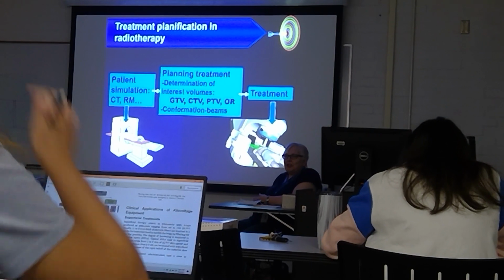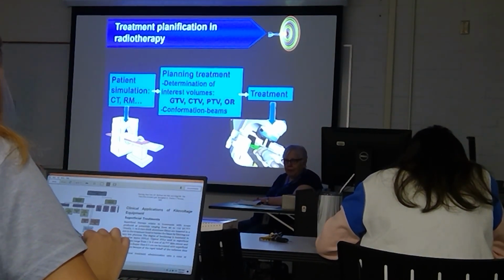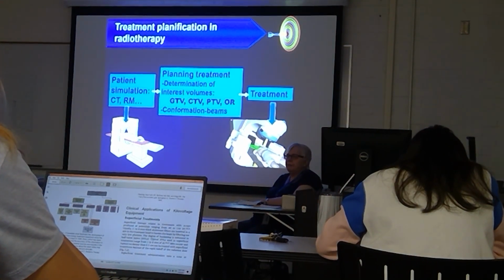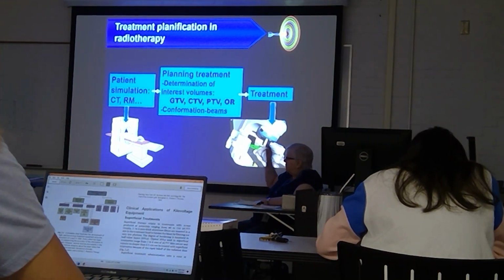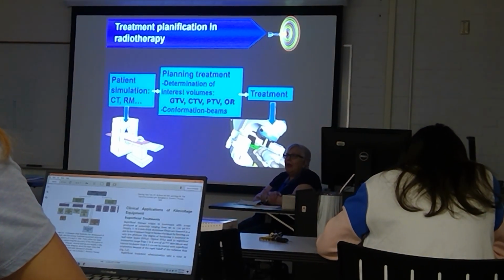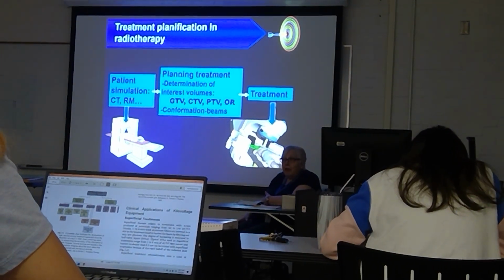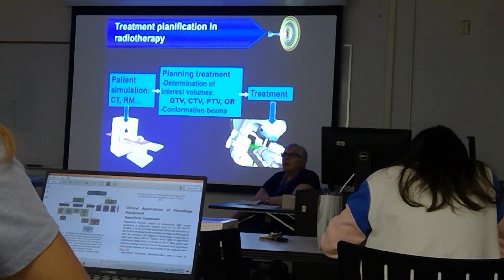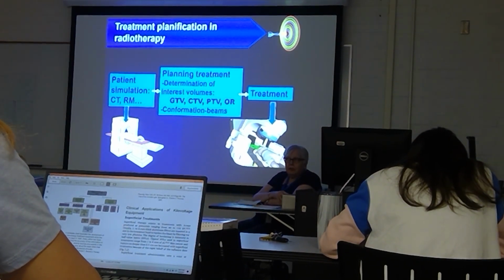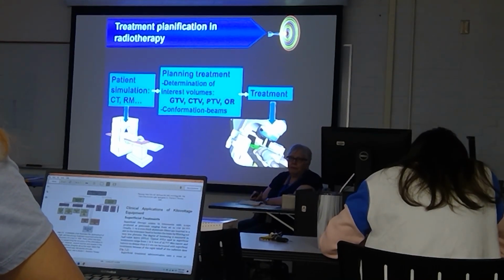99.5% of our patients, we do head first in CT. Give me something that wouldn't be treated head first. The bottom of the foot. The foot, actually, I was just about to say, till mid-thigh. If you were treating any of the leg, you'd probably put them in feet first. But anything else, you put them in head first.